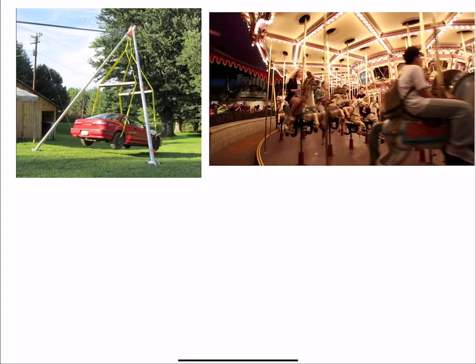So typically the way that's done, we have this B naught field, which is like 3 tesla, which is essentially, let's say, 30,000 or 60,000 times the Earth's magnetic field? Super strong field. And to tip this away, we're going to apply a very tiny field, which we call the B1 field or the radio transmit field. That field is actually very, very small, on the order of the Earth's magnetic field or less. So the question is, how do you get something going with a very small field when it's being influenced by a very large field?